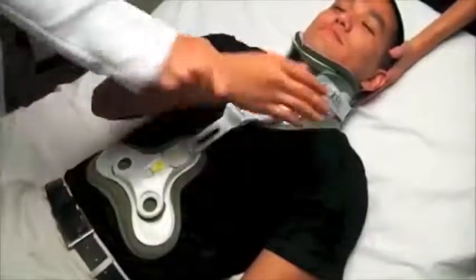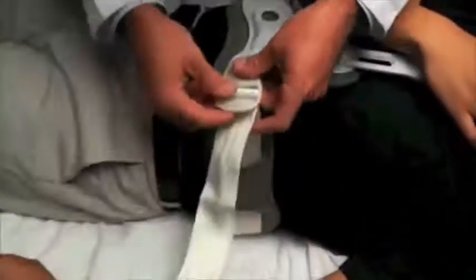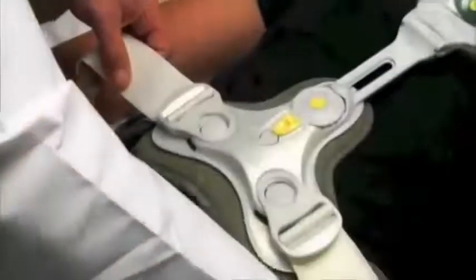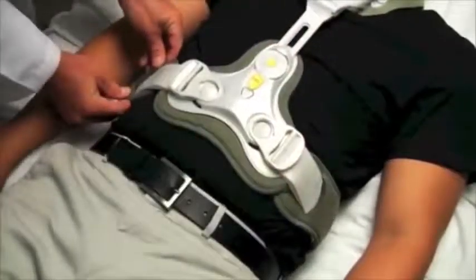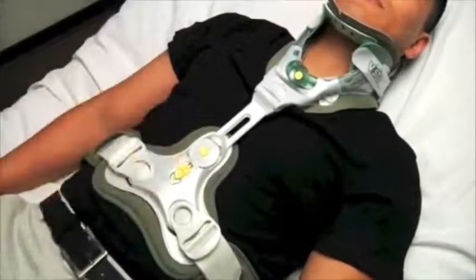Slide the yellow button up to engage the primary lock. Next, slide the back panel under the lumbar spine. Attach the back panel clips to the sides of the vest and hold the straps evenly until the back panel is tightened. Adjust the strap padding as needed for patient comfort. When the patient moves from laying to sitting or standing, simply unlock the height adjustment dial and refit.